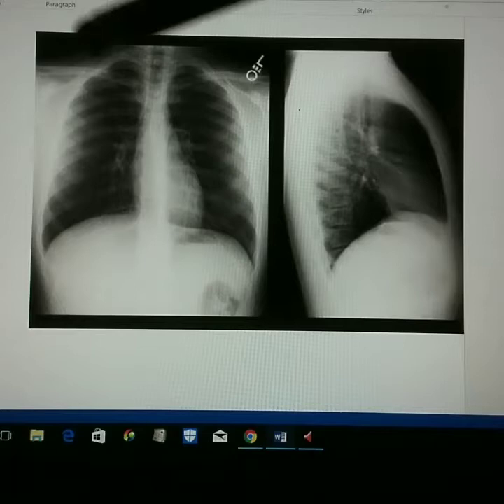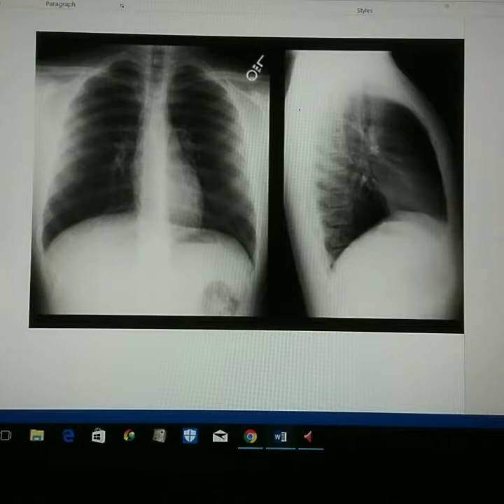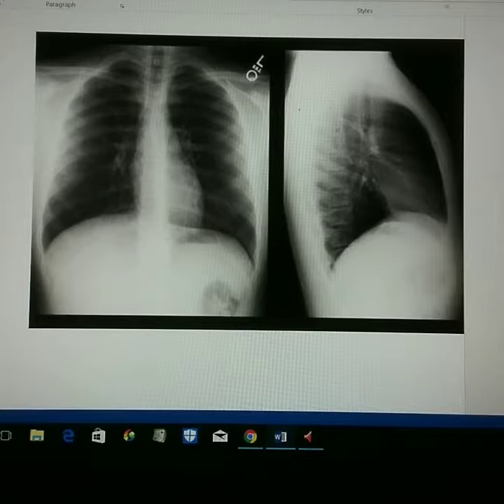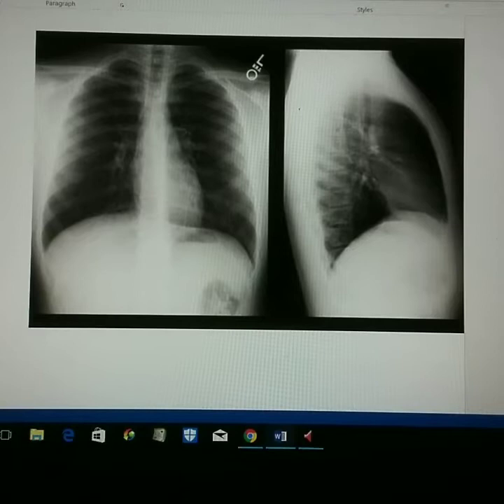As evident here, we have a nice heart shadow and diaphragm. We also want to make sure that we can see the thoracic vertebrae and the shadows of the ribs through the heart shadow, which is evident there. We have nice, good-looking lung markings visible from the hilum right in here.